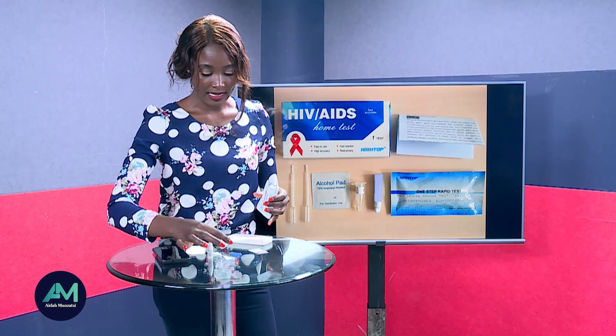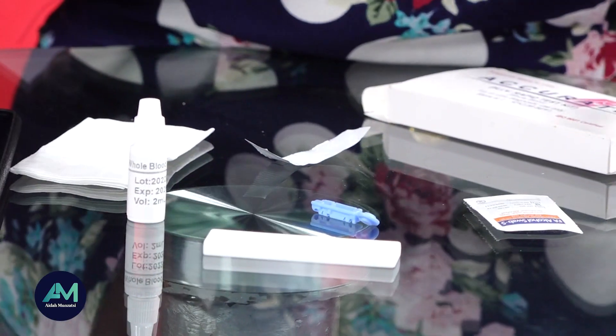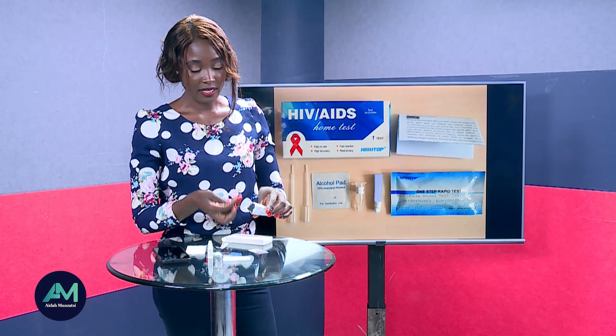You place the test on a flat surface — this is where we will be putting our blood. Then we have this tube right here, known as a pipette; this is what we'll use to collect the blood sample.